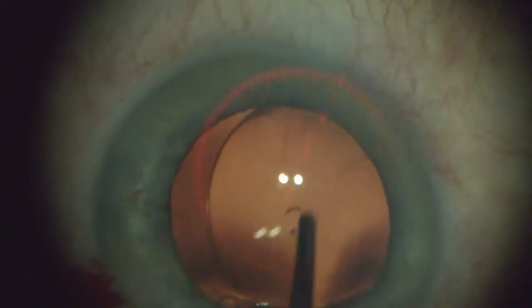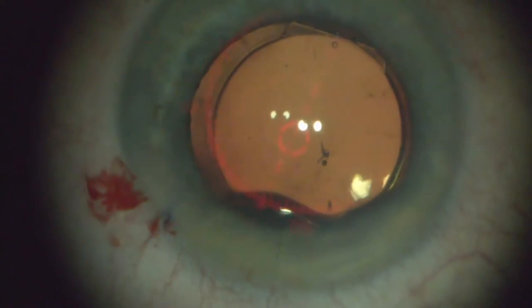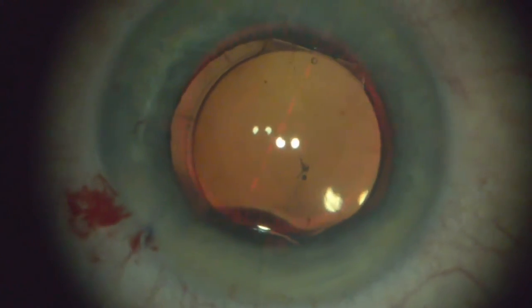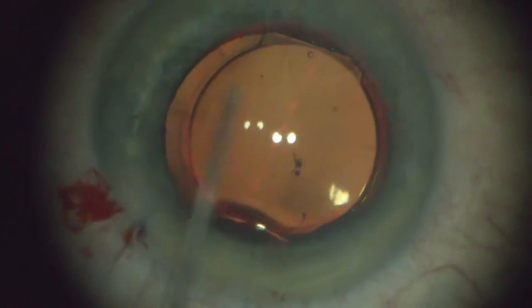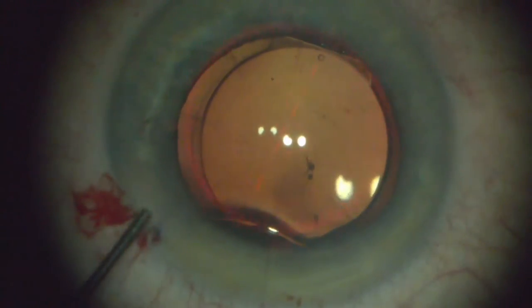I am rotating it, just to make sure it's in the bag. I'm going to rotate it into the axis of astigmatism — the steep axis of astigmatism. And I'll show you this in just a second on this video.